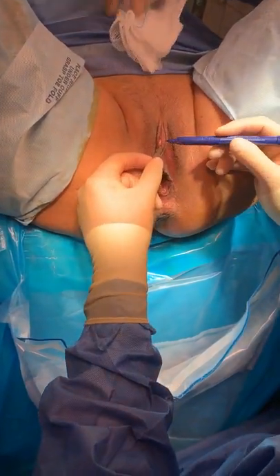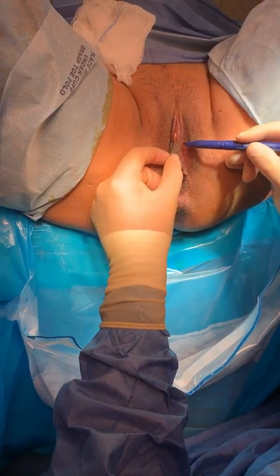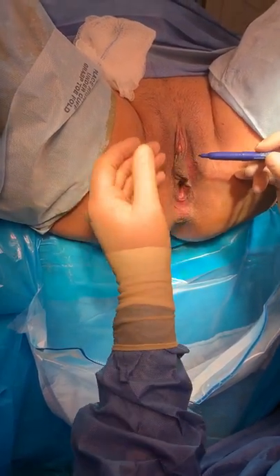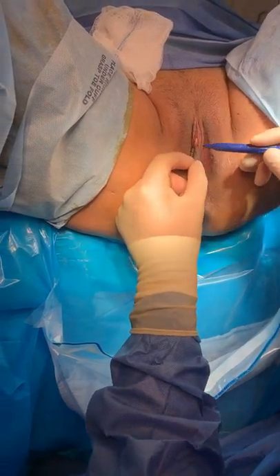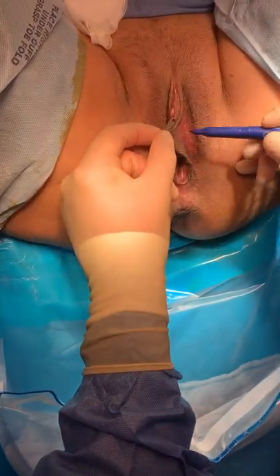Start with one side. I try to respect Hart's line, so the usual rule of thumb is you want to stay at one centimeter above, below the clitoral hood, so that if it does retract, we don't want to amputate her labias. I usually just use my surgical marking pen, and the labias are telling me where to go anyways.